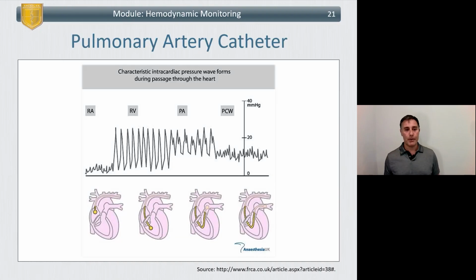Let's talk then about pulmonary artery catheters in general. We don't use them a lot in pediatrics. It's generally adolescents, just because of the sizes; for the smallest ones, you've got to be about 4 or 5 years old to get a PA catheter in. But they are used nonetheless, and they're very testable because of just how easy it is to ask questions about it. And the important part about floating a Swan is just to be aware of what changes you're going to see within the pressure waveforms as you're advancing the catheter into the heart.